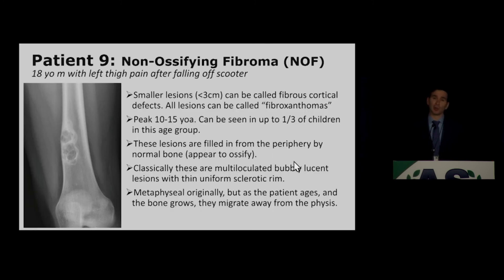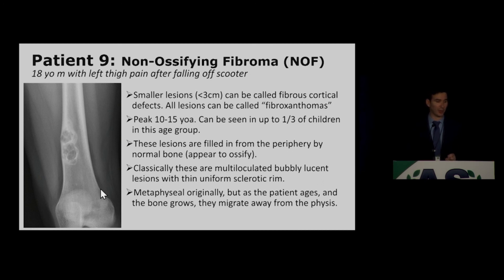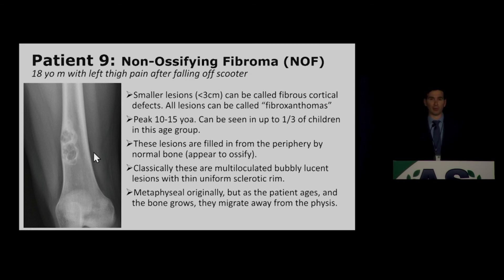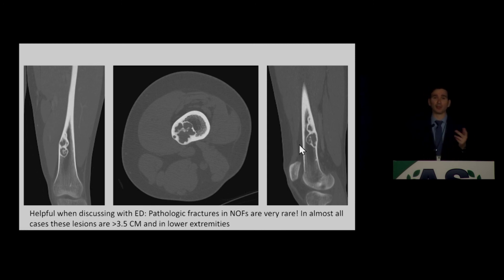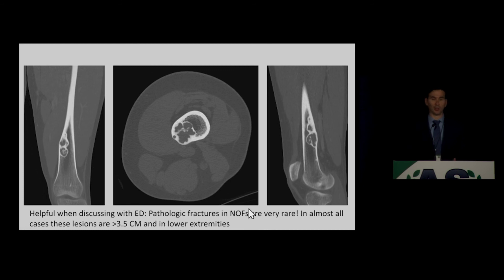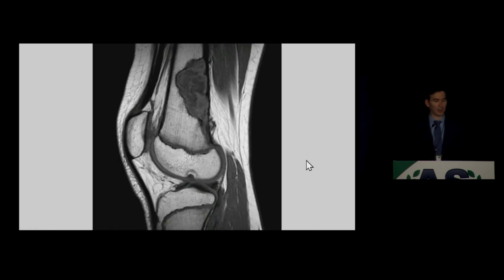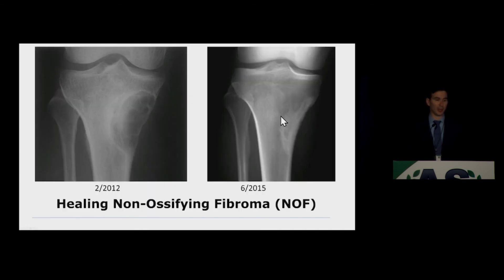Patient 9 shows the typical appearance of a non-ossifying fibroma (NOF): a cortically-based, eccentric, lobulated, lytic, bubbly lesion with very sharp margination and narrow zone of transition. These can be seen in up to one-third of children. They're often metaphyseal in origin but appear to migrate into the diaphysis as the bone grows. Pathologic fractures of NOF are exceedingly rare and almost all reported cases occur in very large lesions in the lower extremity. On follow-up, these ossify from the outside in.